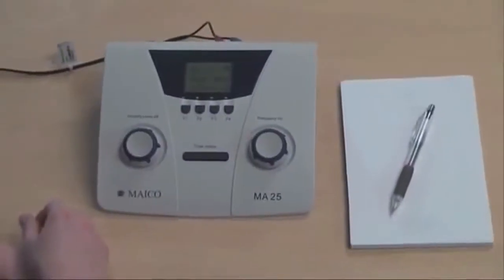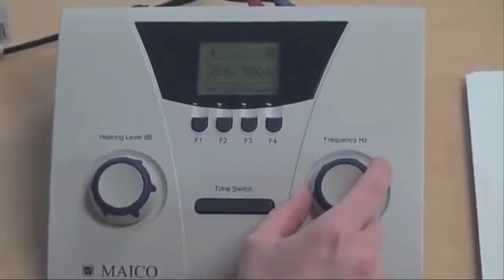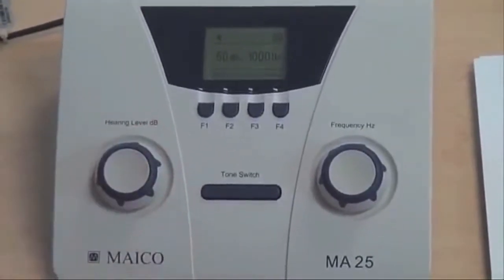On the audiometer, select the right ear and set the frequency dial to 1000 Hz and the level dial to 50 dB. Play the tone by pressing the blue tone switch. The child should raise their hand. Repeat to make sure that the child understands the task. If the child does not respond, re-instruct the child and try again. If the child still does not respond, they should be referred on for further testing.